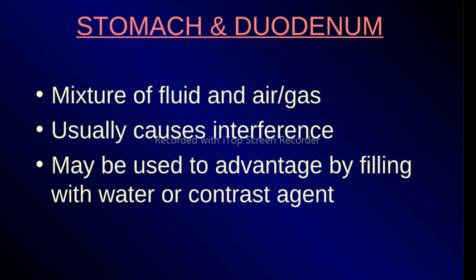The stomach and duodenum contain gas, and gas, as you know from your physics, is problematic in ultrasound imaging because it gives us dirty shadows. So one way to overcome that is either to change the patient's position or ask the patient to take water, not soda. Soda will add to the problem because it contains pressurized gas. When the patients take it, part of that gas is released and becomes free gas and adds to the problem.